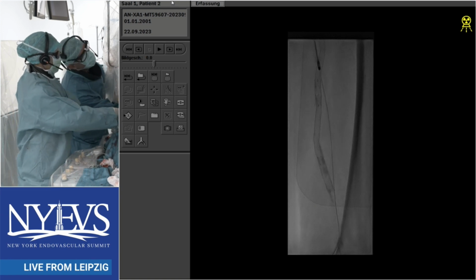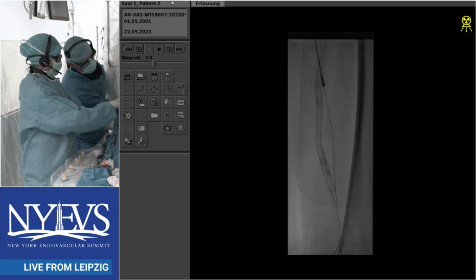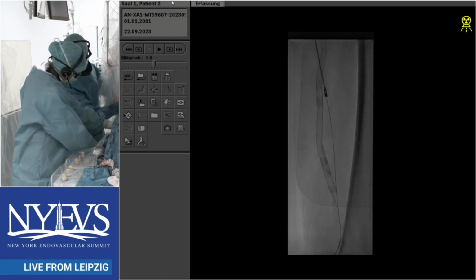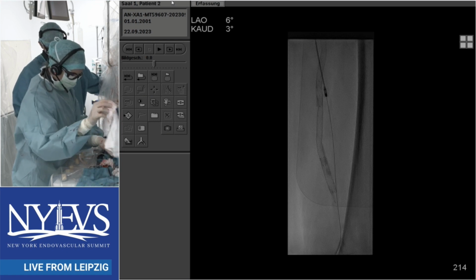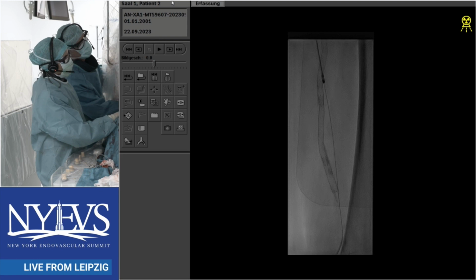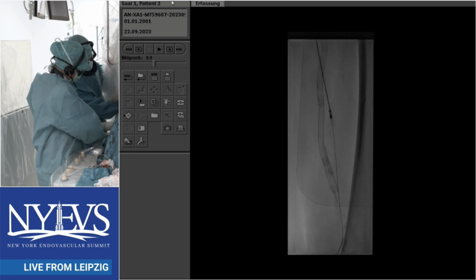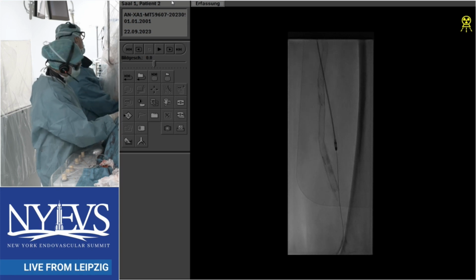Jim, would you use Jetstream here? Well, I don't like opening up old PTFE grafts. There's going to be intimal hyperplasia at the proximal and distal anastomosis, really. There's only going to be thrombus and well-organized thrombus, but even if I'm operating, I'll put a new piece of PTFE in rather than trying to open the old one. So I think this is kind of a heroic effort here. I think Jetstream would work fine here, too. Would not use a directional atherectomy device or laser, because most of this is going to be thrombus, and you're just not going to get that much luminal gain. So I would use some type of rotational device, as you see here, but pay specific attention to the proximal and distal anastomosis.